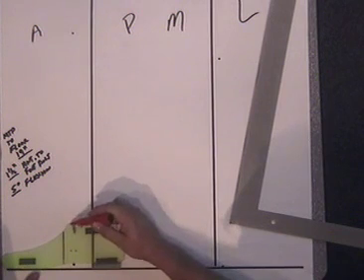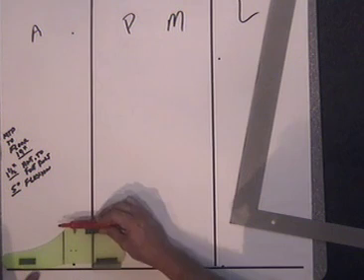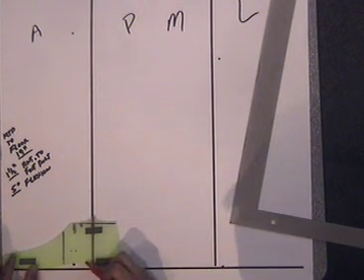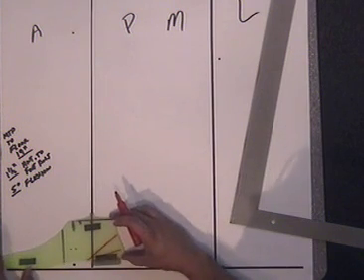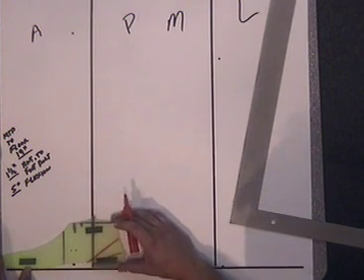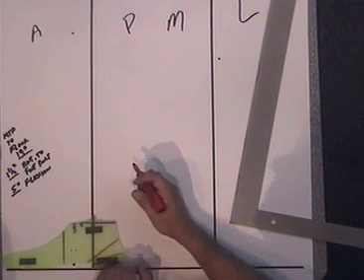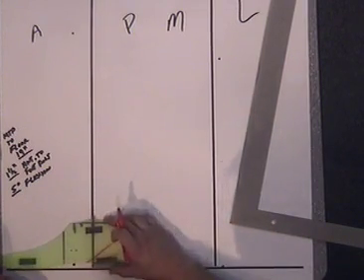So if you look here, the top of the foot is parallel to the floor, maybe leaning slightly about 2 degrees anterior. When you're setting these up, remember the SACH foot has a SACH heel in it like this, and when the patient steps on it, it's going to compress, and as it compresses, it's going to tilt the pylon posterior. So it doesn't hurt to have about 2 degrees of tilt to the top of the foot when you're setting this up. So that's the first step, is to place the foot in there.